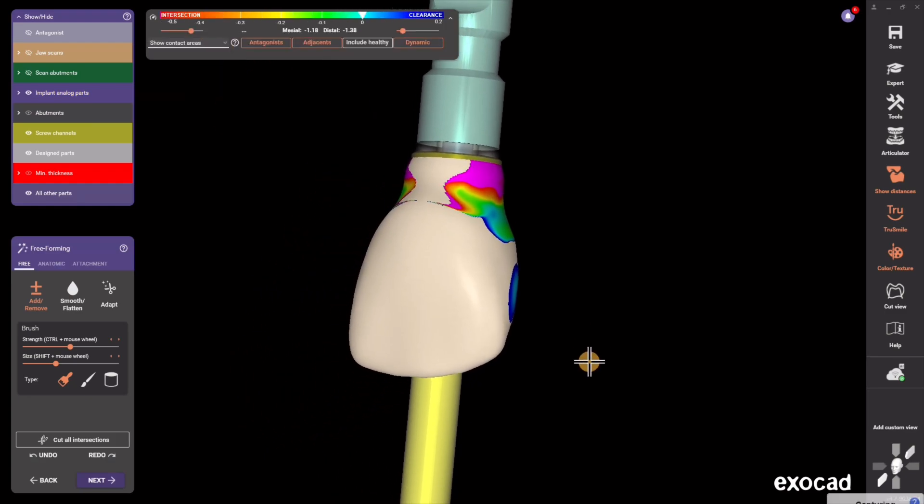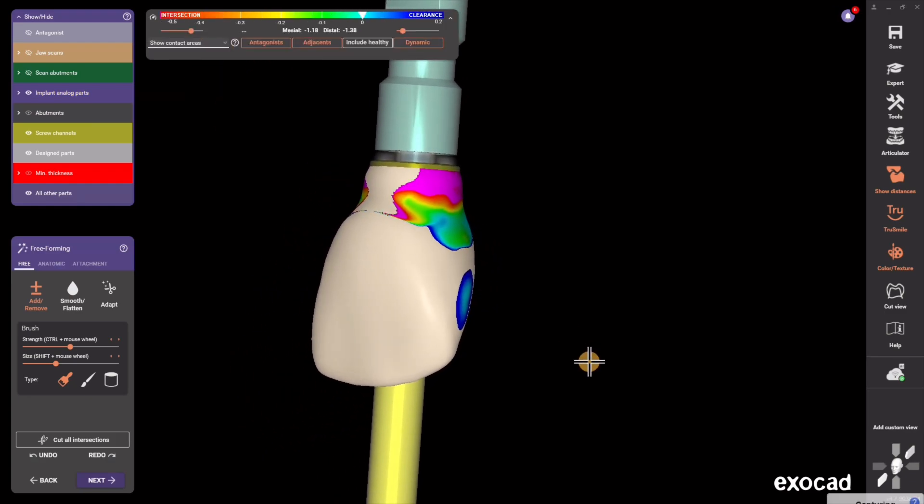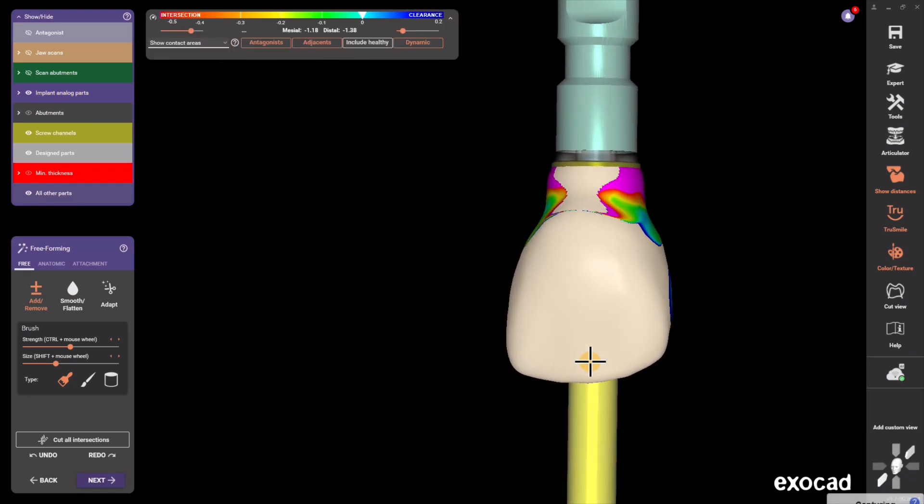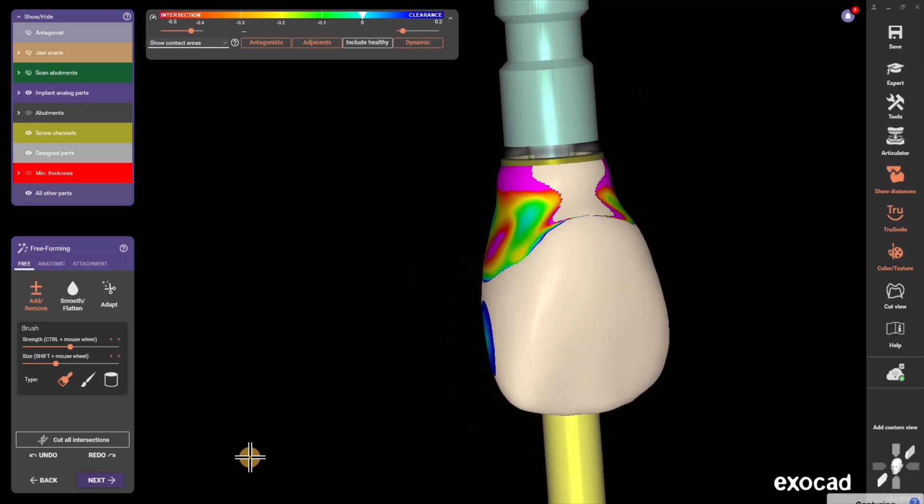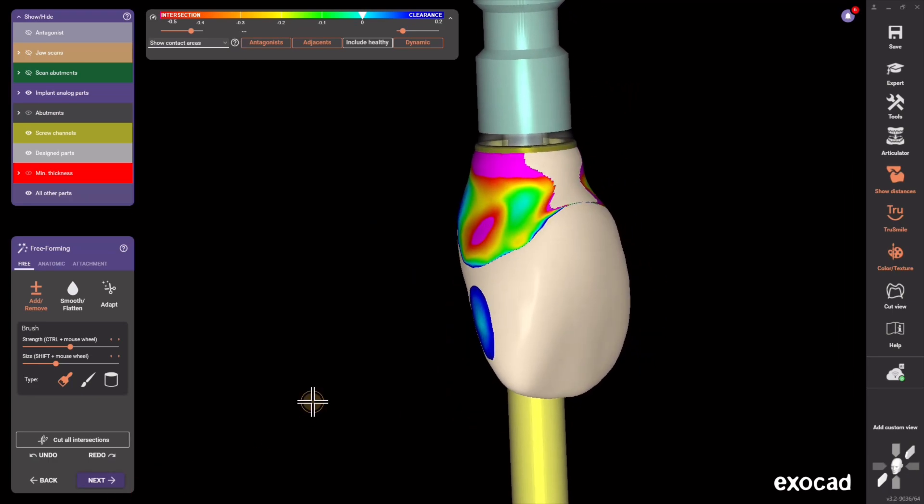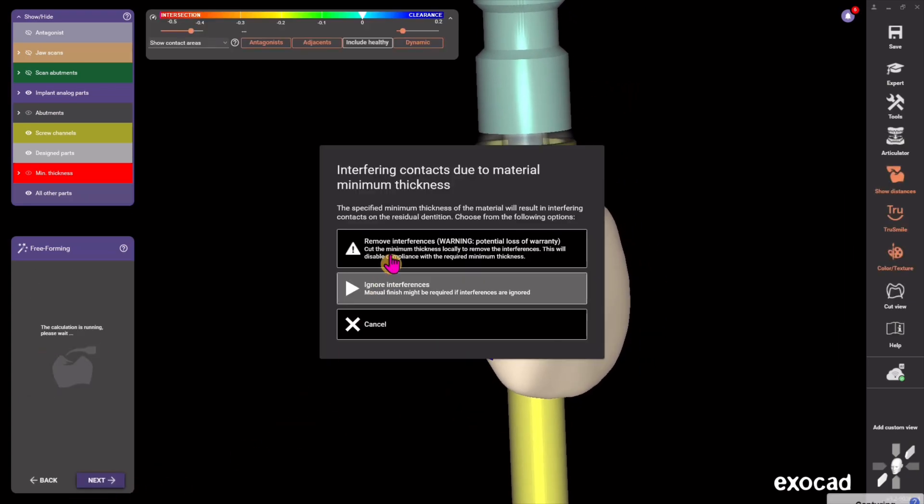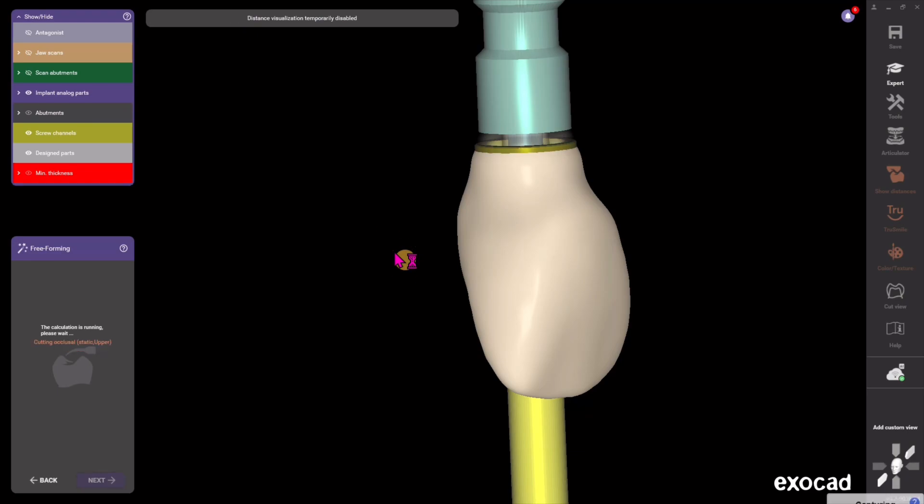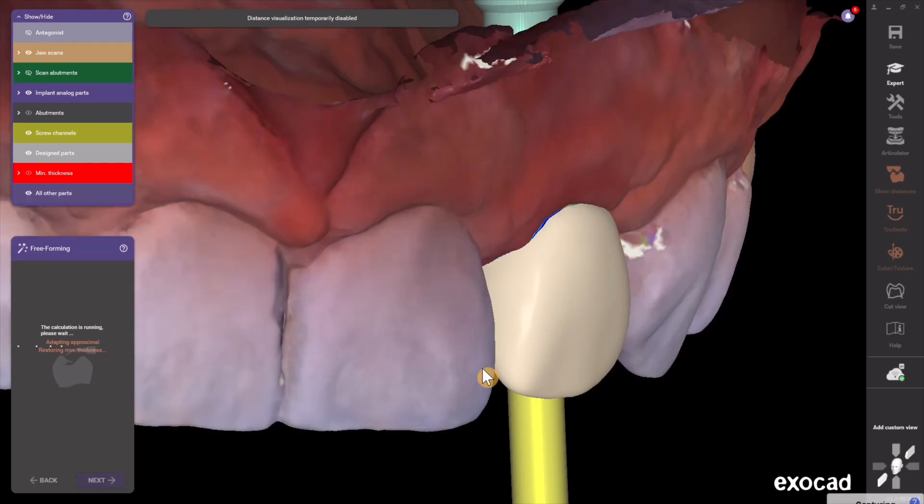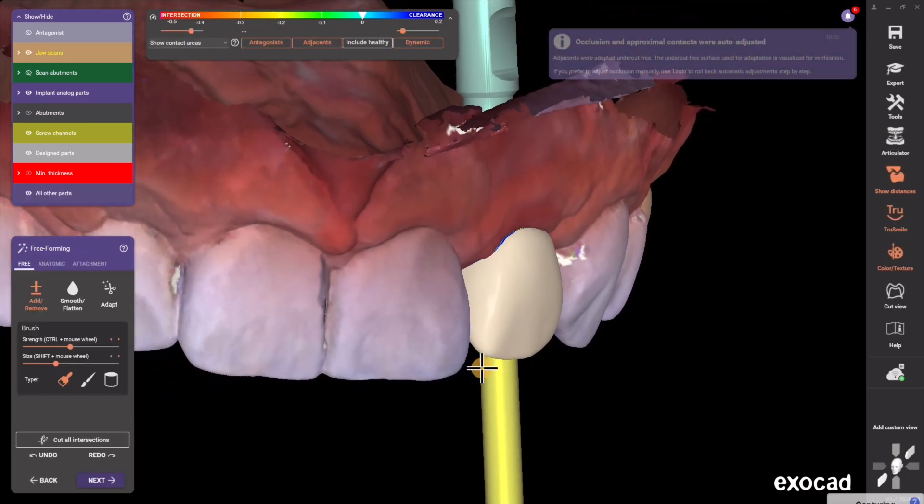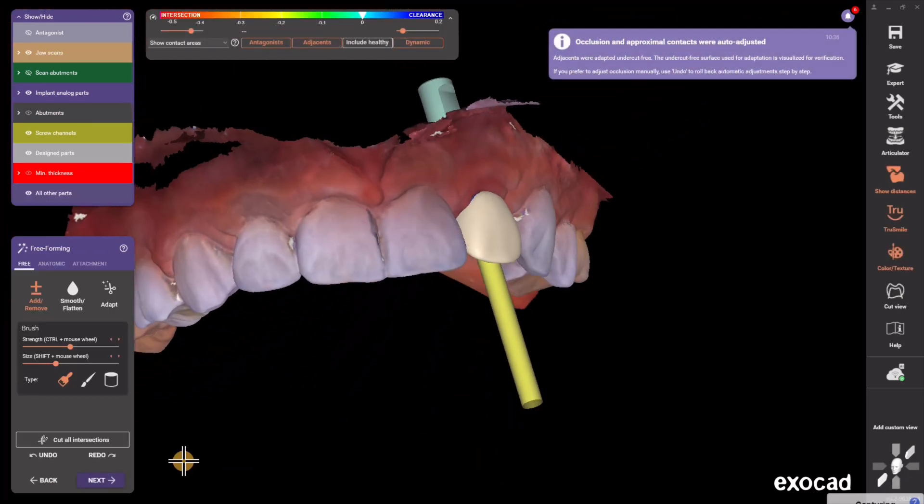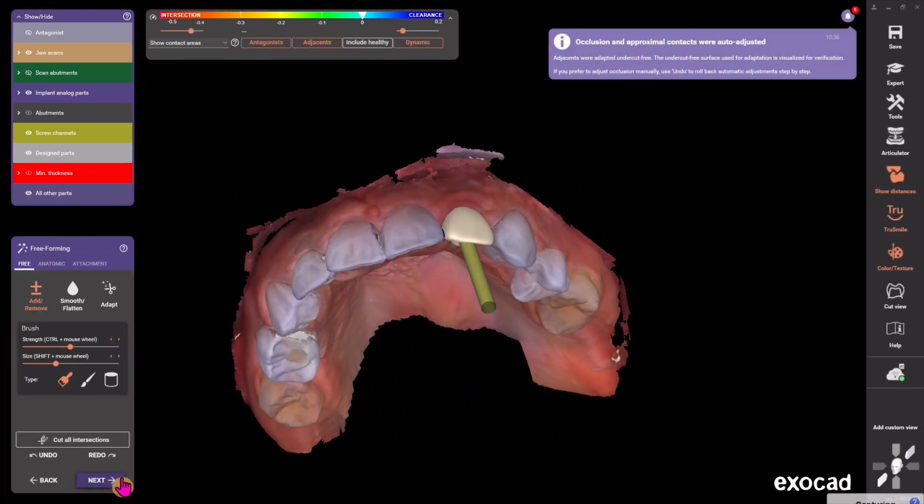So now I'm going right back to proximal contact view. Everything looks good so I'm going to just hit Next here and I'm going to hit remove any interferences, and that is basically it.